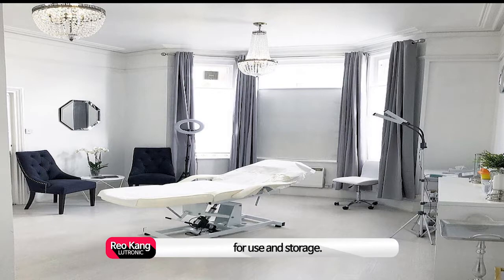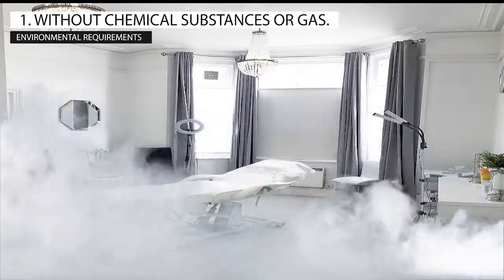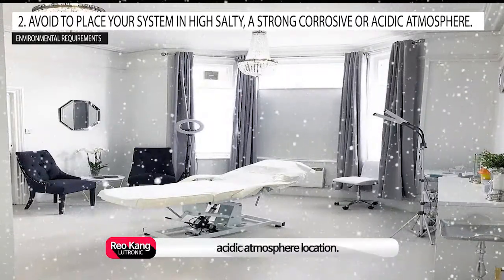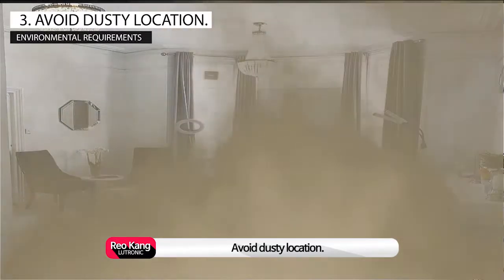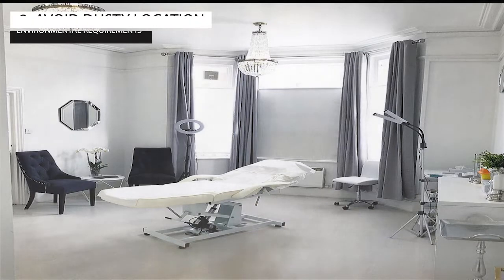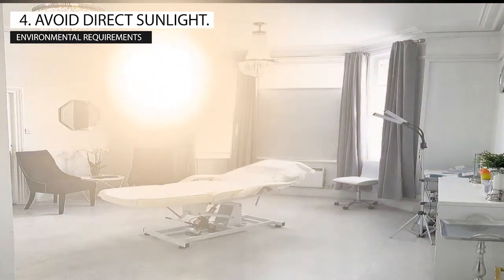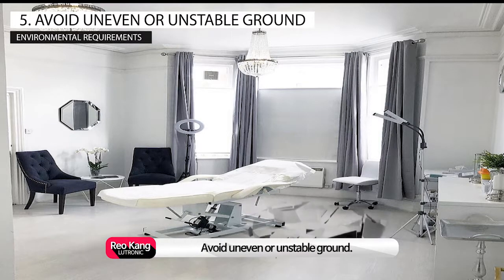These recommendations are applied for use and storage: avoid chemical substances or gas; avoid high salty, strong corrosive or acidic atmosphere locations; avoid dusty locations; avoid direct sunlight locations; and avoid uneven or unstable ground.